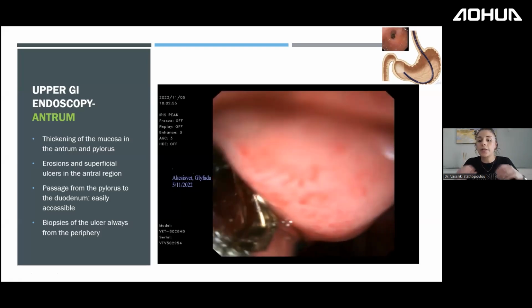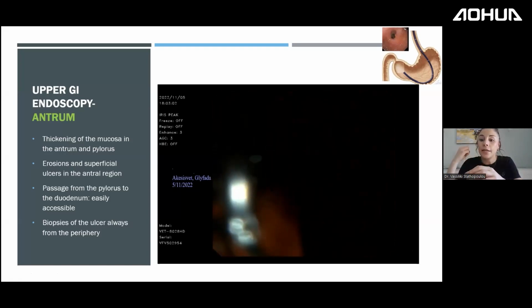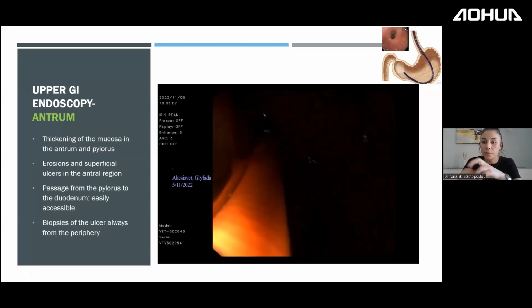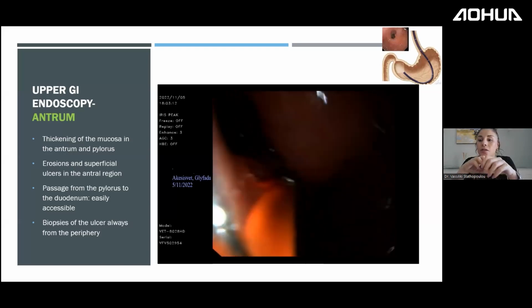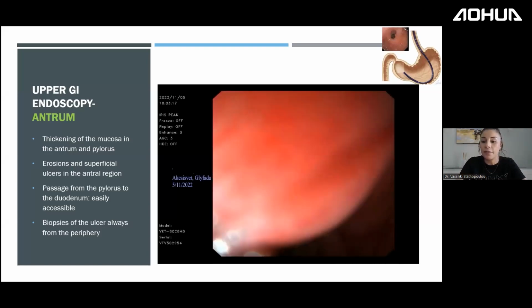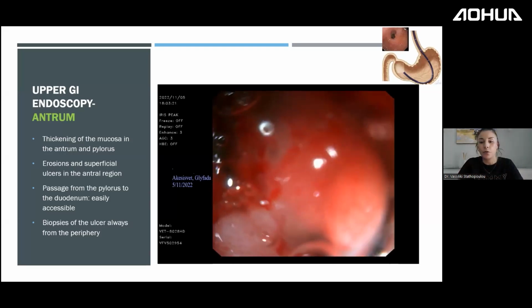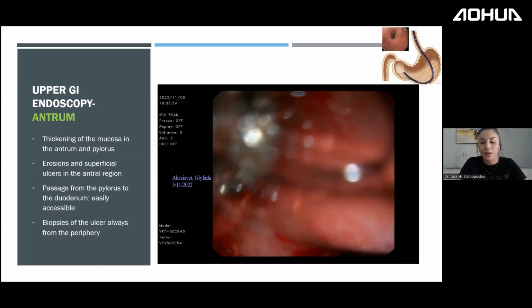So what we do is that we proceed our forceps. We take the air out so that all the tissue comes into our forceps, and you try to be vertical, because these lesions are very hard and very slippery. It's very easy to slip away from the lesion. And then you see if it's bleeding. Of course the whole stomach is bleeding, but if you caused some bleeding, your sample is representative. Okay.